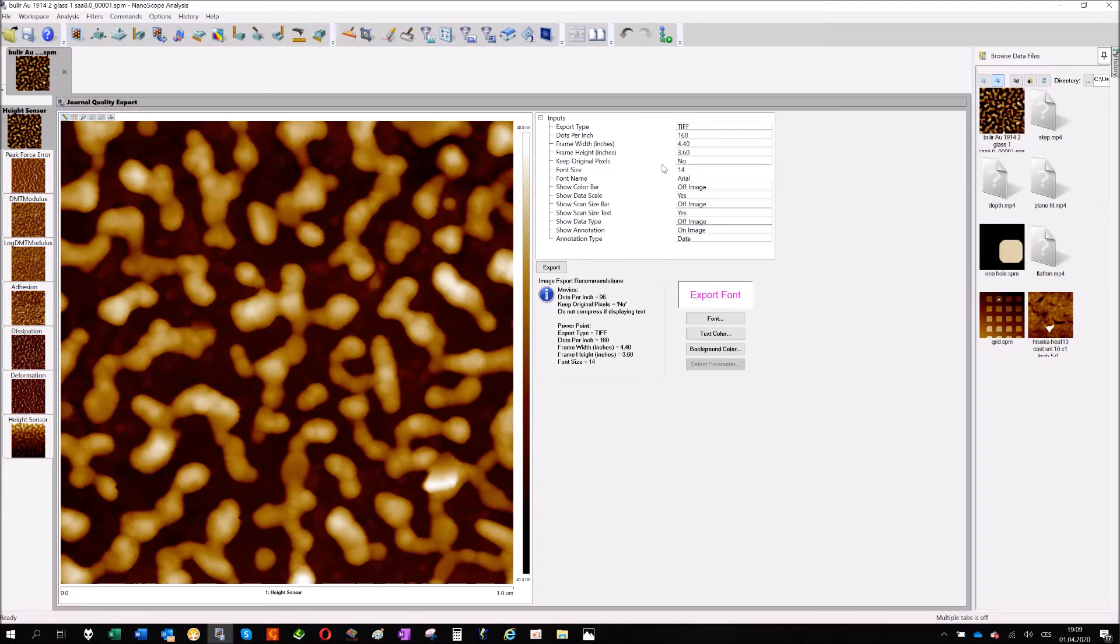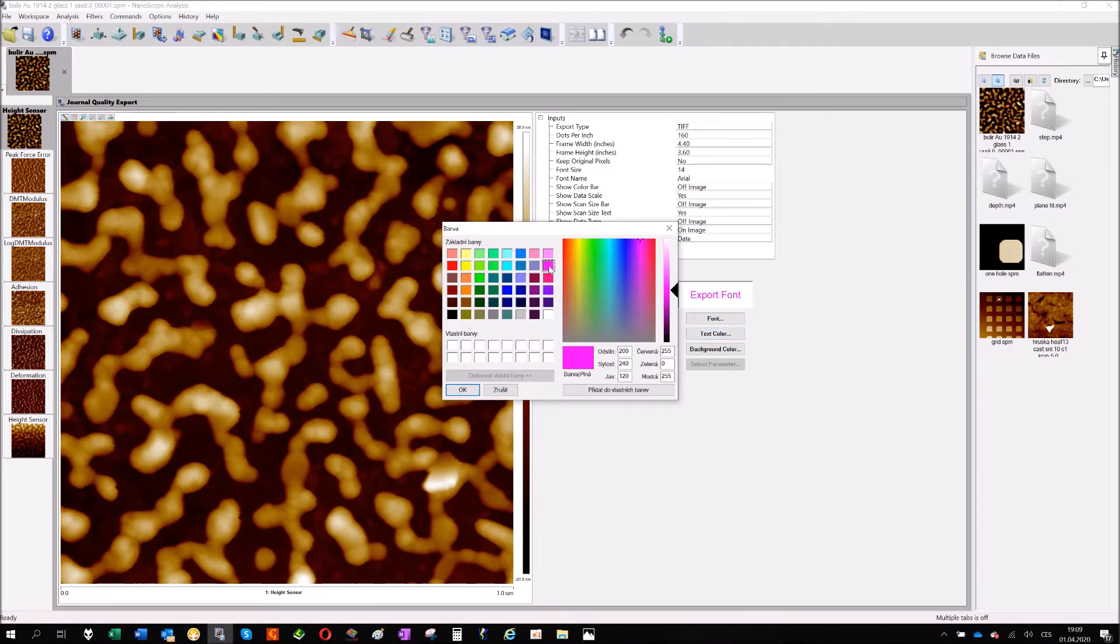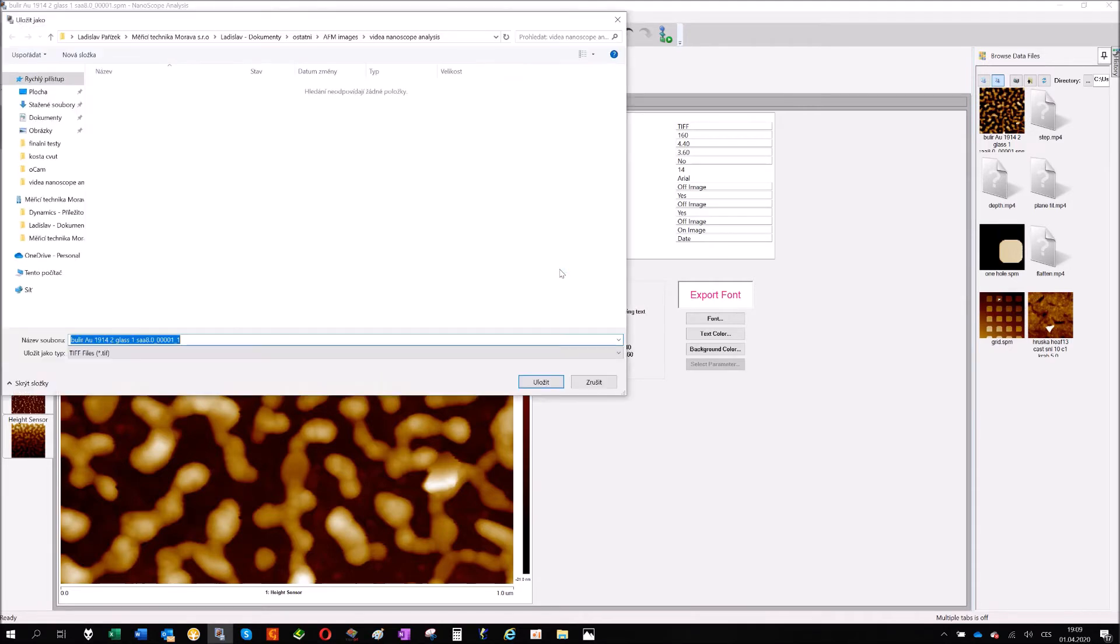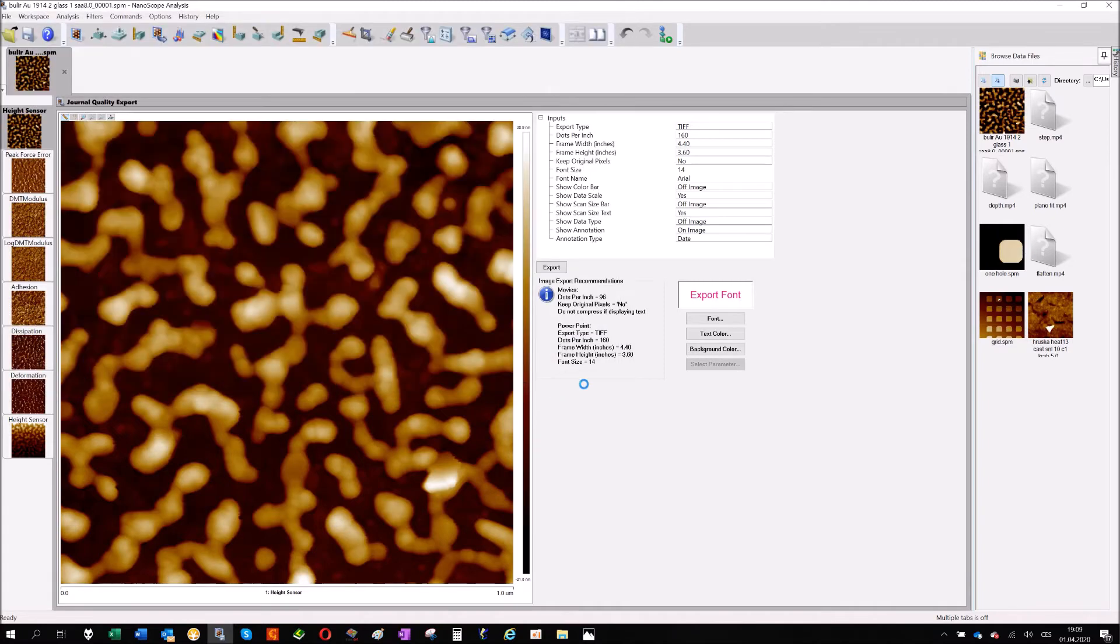You will just define what kind of color and the font you want to have. Something that's okay for you, and click export and just save it.